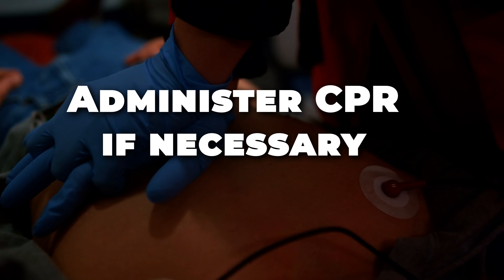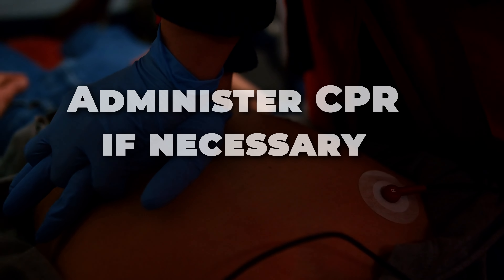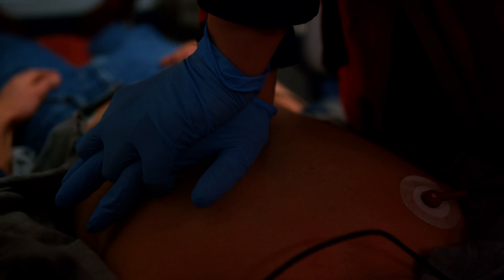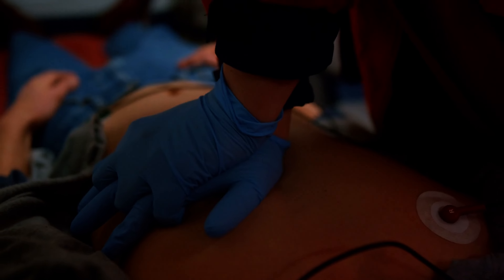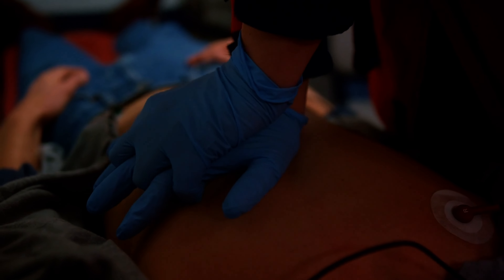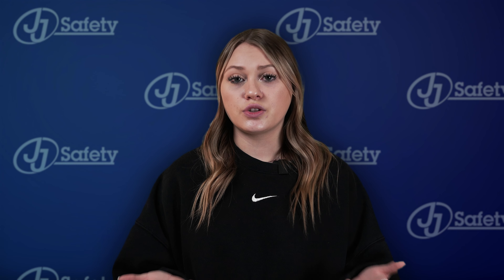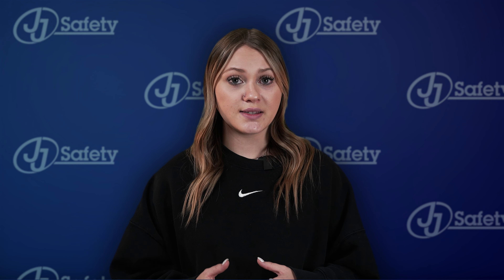Step three: administer CPR if necessary. Start CPR after the shock is delivered, if CPR is still needed. The AED will guide users through the CPR process.